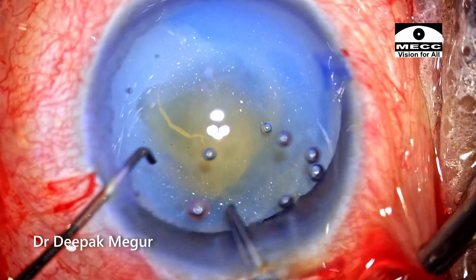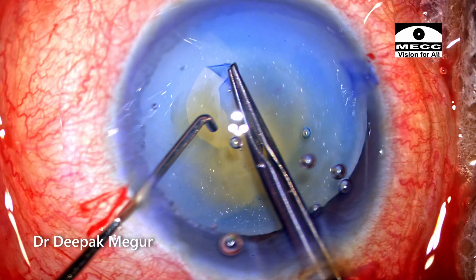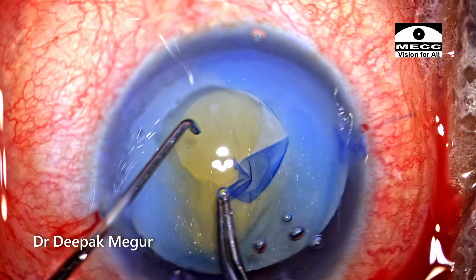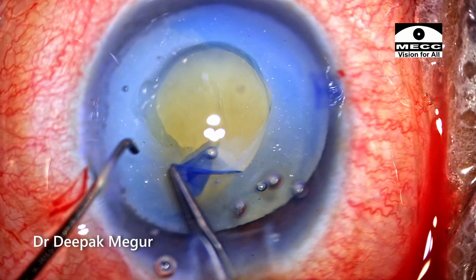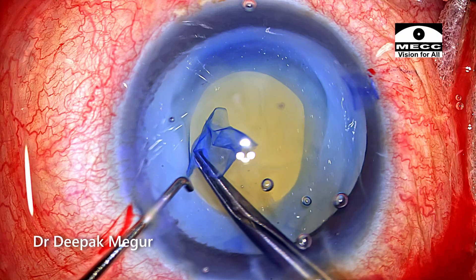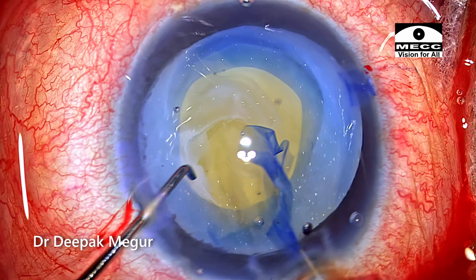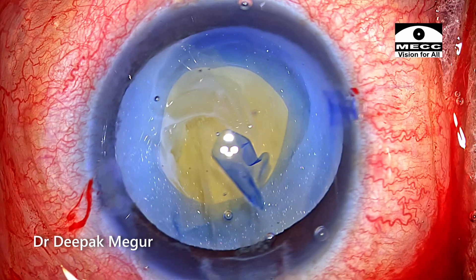Time to perform the rhexis. Using rhexis forceps, I'm holding the flap and creating a rhexis of appropriate size. As I'm performing the rhexis, I'm happy to realize that the zonular health is very good — not seeing any wrinkling of the anterior capsule and the tearing is quite controlled. I'm aiming for a 5 mm rhexis. I think it's slightly smaller, about 4.5 mm. Since the nucleus is going to be smaller, I don't expect this to be an issue.